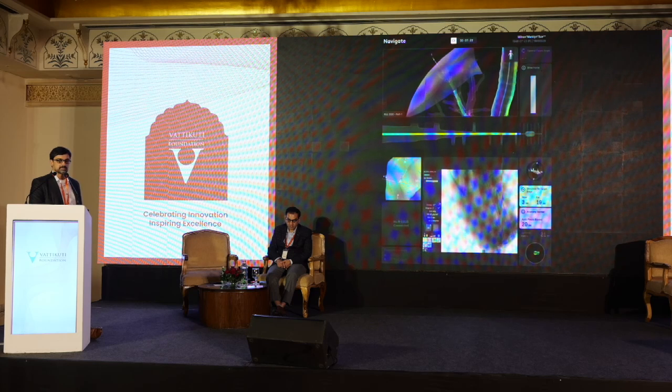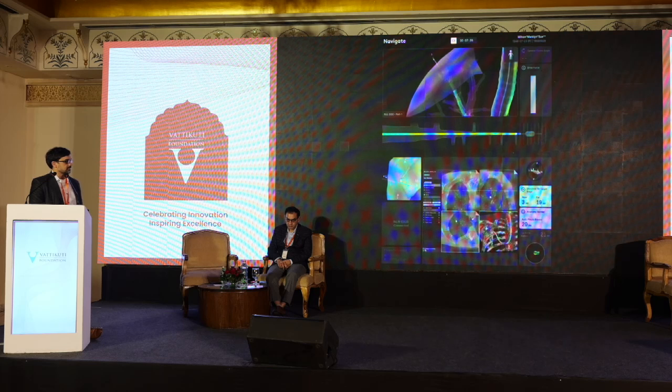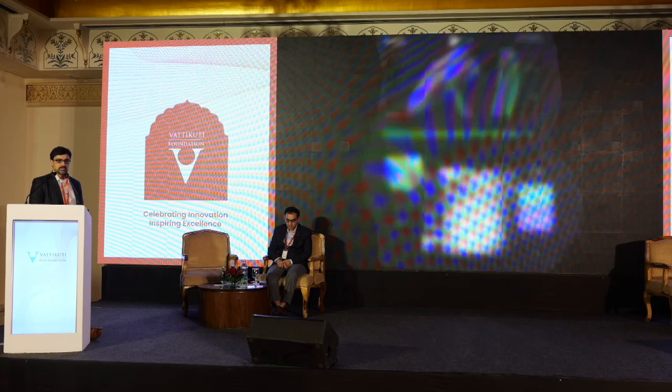We then do a cone beam CT scan on table, and the cone beam CT scan, which we'll see in just a second, ensures that the catheter is directly going into the tumor or right adjacent to the tumor. And so that again confirms placement.